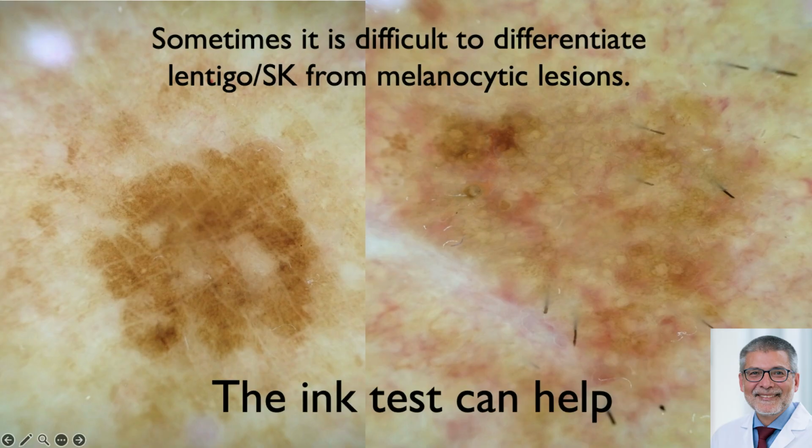So here are two lesions. You stick your scope on, and it's like, I have no idea what's going on here. I've got nothing to anchor my diagnosis on, and so by default I have to be thinking about cancer, right? But I can tell you that on the clinical eye, on side lighting, I already know what this is. But I can bring that third dimension out for you. And if you are also teaching residents, this is a neat one to show residents.